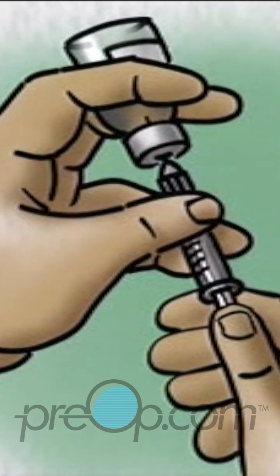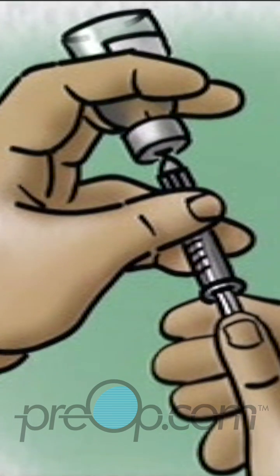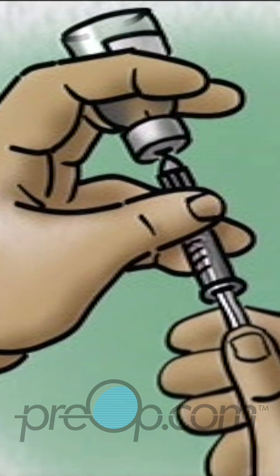With the tip of the needle kept in the liquid, withdraw the dose of clear insulin — in this example, 10 units. Remove the needle and syringe.